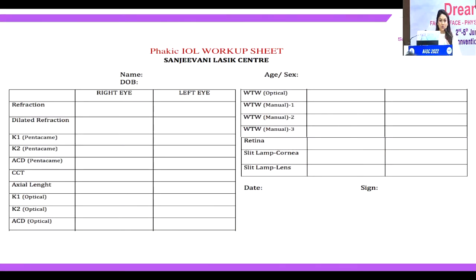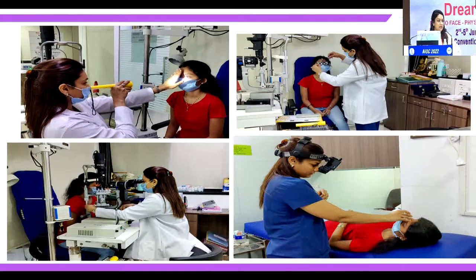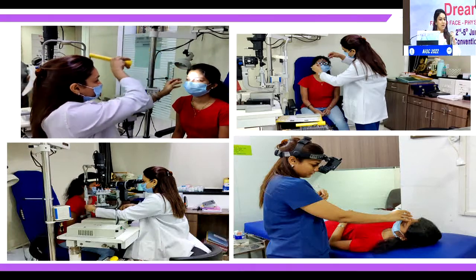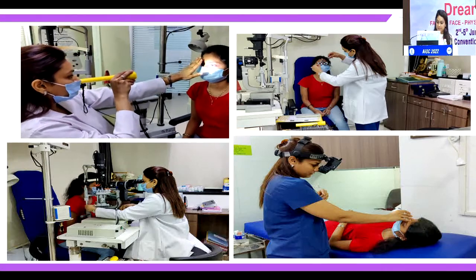So this is my normal protocol, which I'll be discussing very quickly, how I proceed with the phakic IOL in my center. I have made this chart which helps me not forget even one single point, because it's an extensive workup which you need to do. Going stepwise, the first important thing for any surgery is to rule out any extraocular defects, especially in high myopes. There are possibilities of phorias and tropias, so this is something which we need to see.